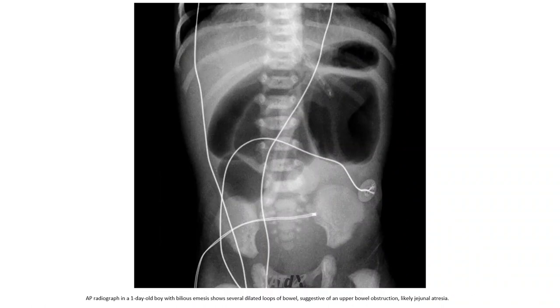AP radiographs in a one-day-old boy with bilious emesis show several dilated loops of bowel suggestive of a distal obstruction, like jejunoileal atresia.